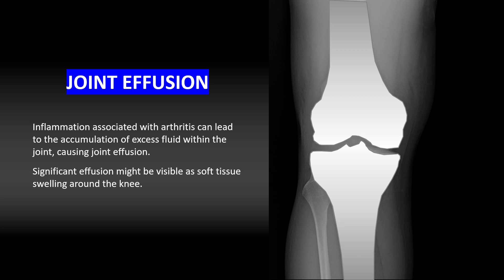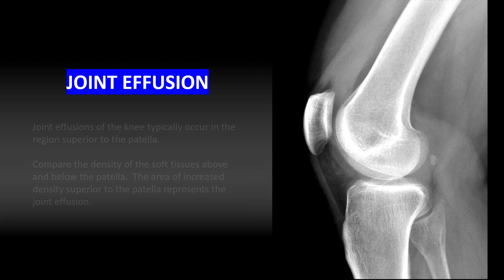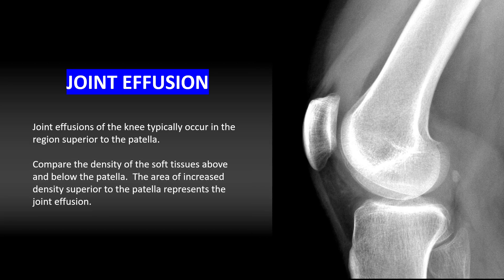A joint effusion may also be present. Inflammation associated with arthritis can lead to the accumulation of excess fluid within the joint. Significant effusion might be visible as soft tissue swelling around the knee. From a radiographic perspective, a joint effusion of the knee is best visualized on the lateral view. Joint effusions typically occur in the region superior to the patella — compare the density of the soft tissues above and below the patella; increased density superior to the patella represents the joint effusion.